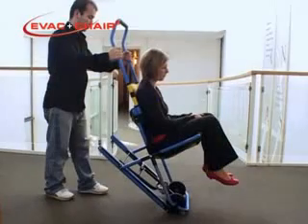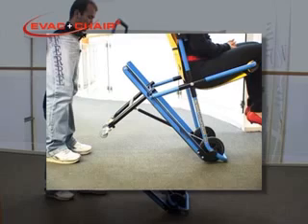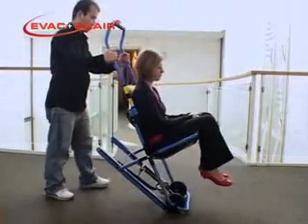For stairway descent, close the trolley assembly in an appropriate area of safety by placing the evac chair in a vertical upright position with the bottom bar of the frame on the ground. Place your foot on the yellow sticker and push the trolley assembly forward until it clicks back into place.